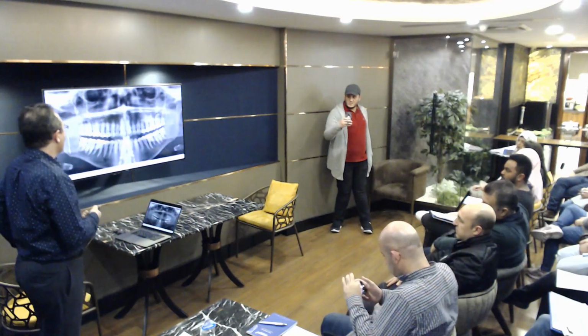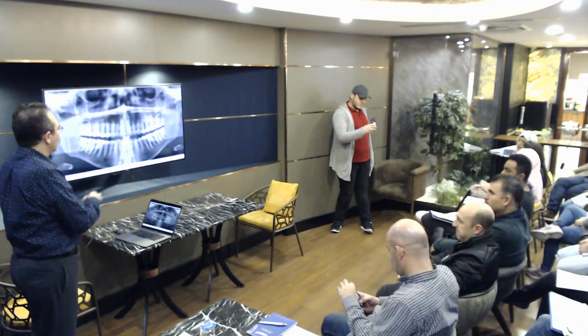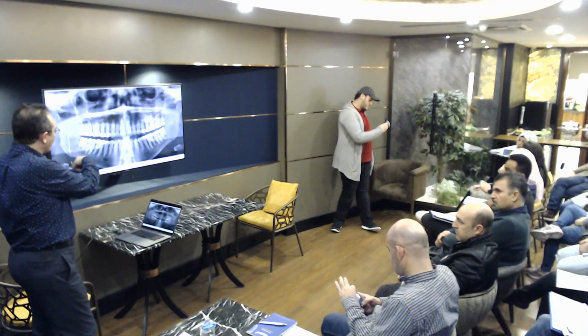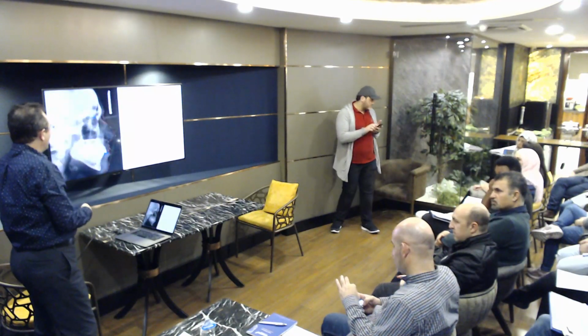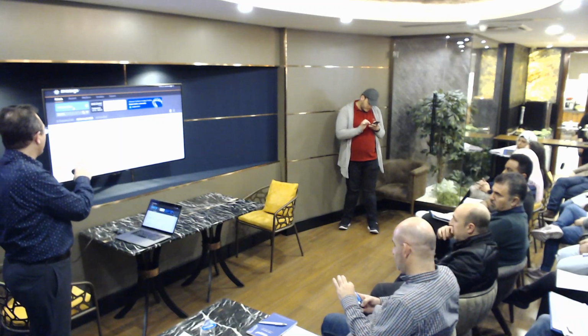The other thing, you might or might not use a panoramic. It's not mandatory, but usually I like to upload it because it's handy for me. If I'm looking for the root parallelism, then I don't have to go back and check my records. I have it in the same file. So this is how the Invisalign platform looks like.